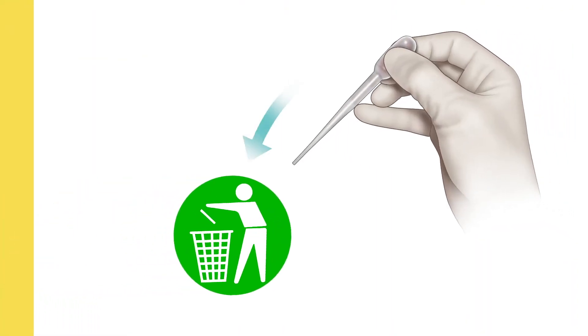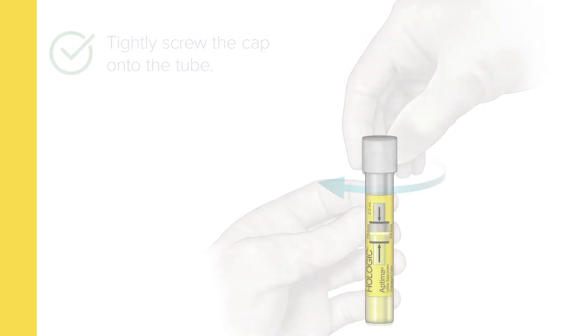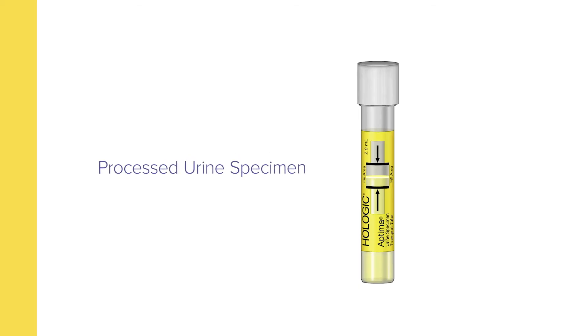At this point, discard the pipette and tightly screw the cap onto the tube. This is now referred to as a processed urine specimen.